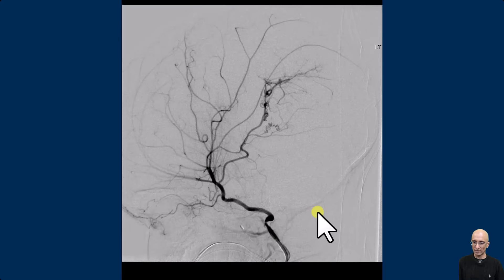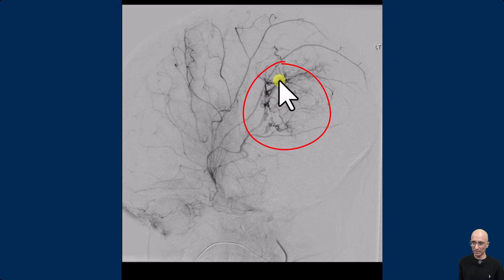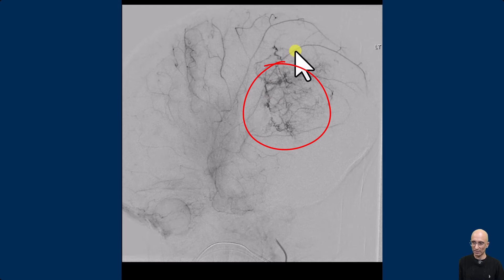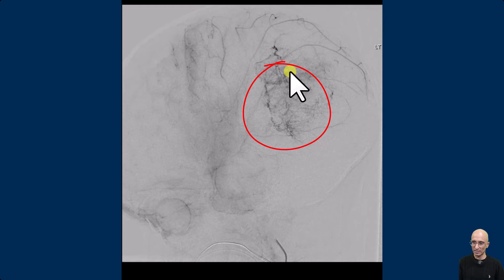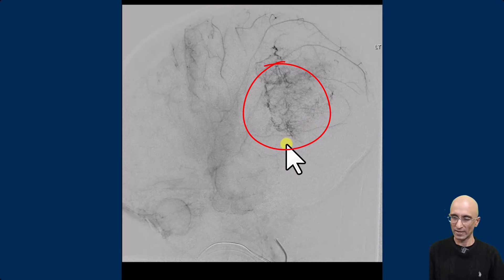The patient underwent catheter angiogram as part of pre-surgical treatment. On the catheter angiogram, you can clearly see the hypertrophied choroidal artery which is supplying the left lateral ventricular mass. You can see avid intratumoral vascularity within the left lateral ventricular mass.